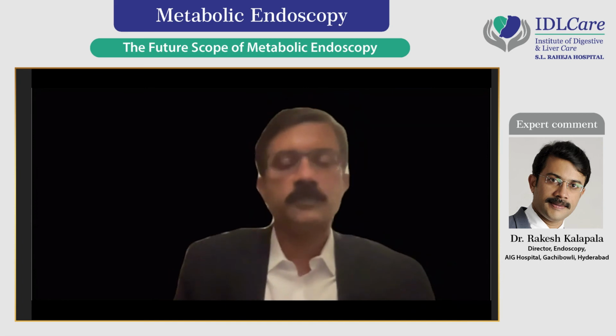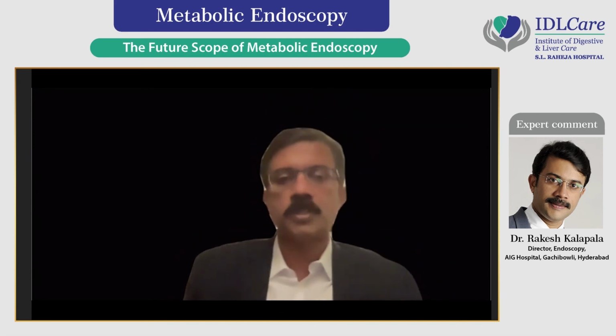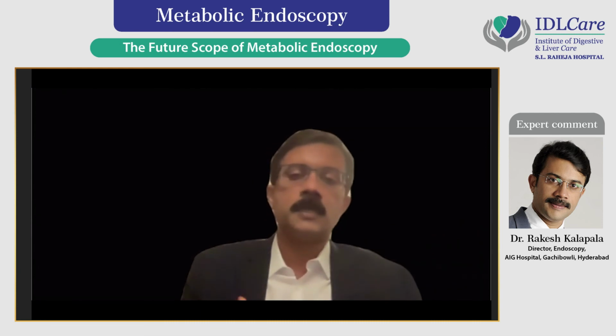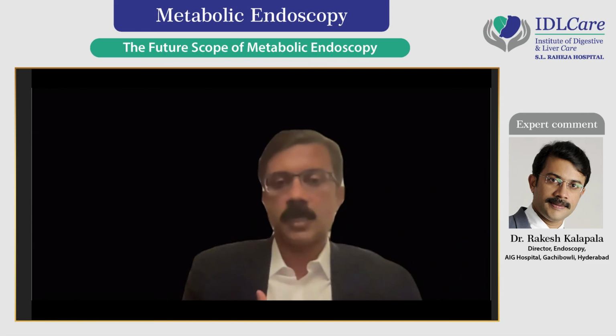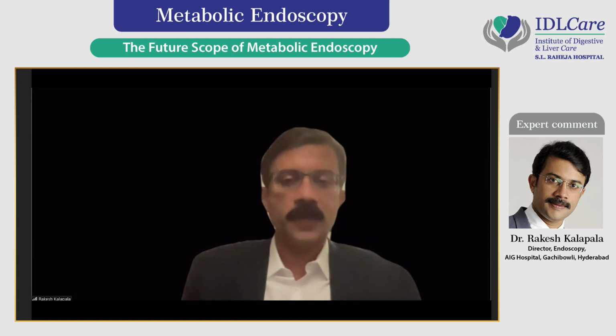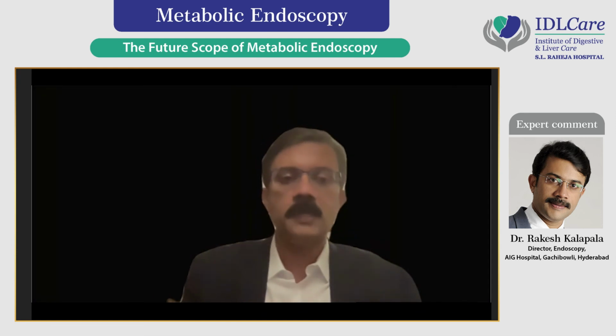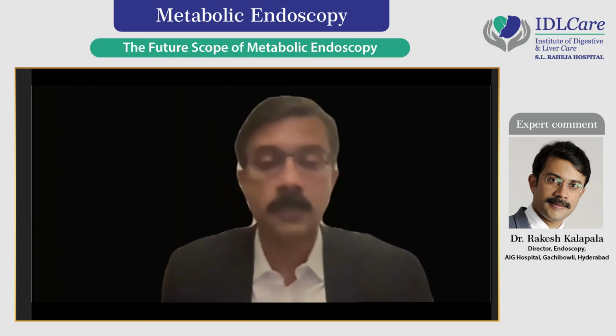And that is one thing which I'm looking forward to as a futuristic thing, especially in a patient who has got standalone obesity, because that mechanoreceptor pressure exertion at the cardia will lead to early satiety. And it's a very simple way of deploying the device. Even the extraction of the device is also very simple. In fact, we have an experience of putting it in max 10 to 15 minutes, and then the patient walks out in the evening and comes back after 6 months to retrieve it. And we have around 15 to 20% robust weight loss with this particular full sense device.